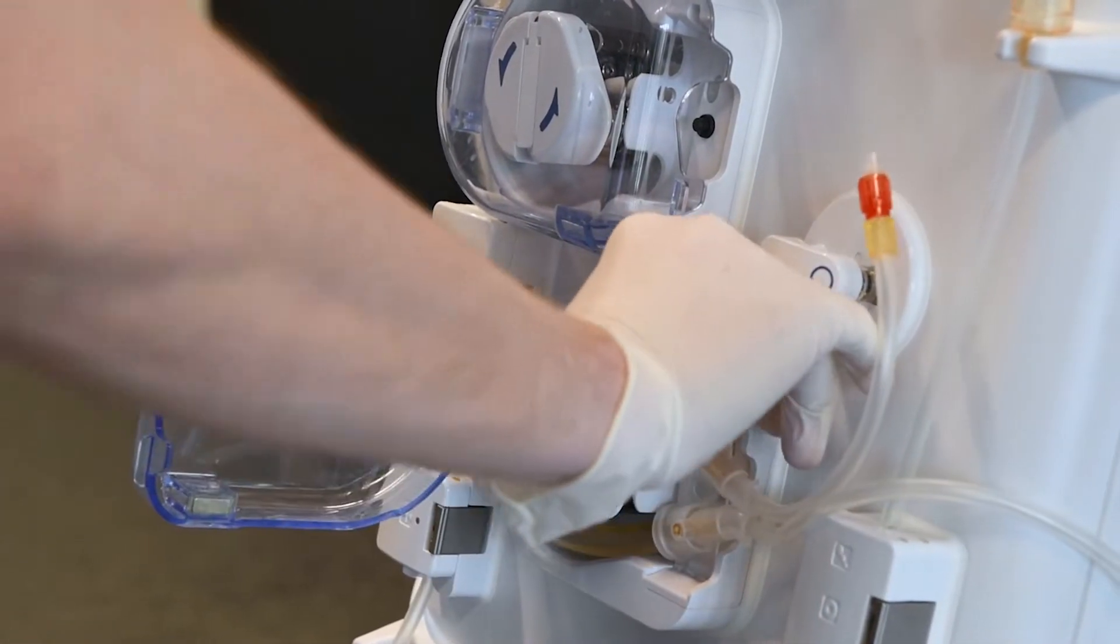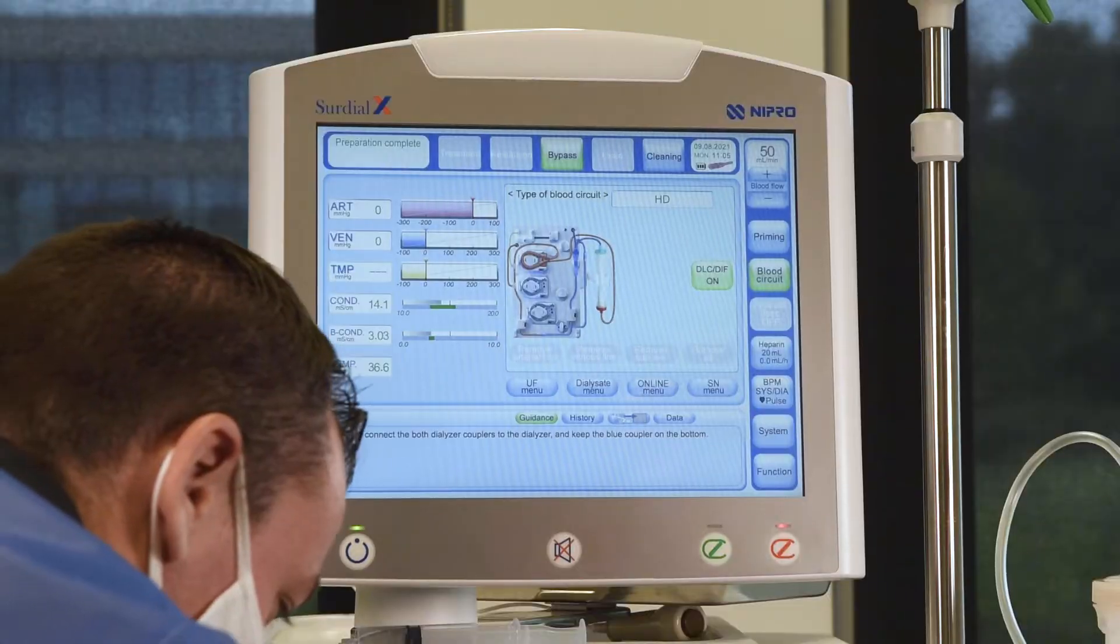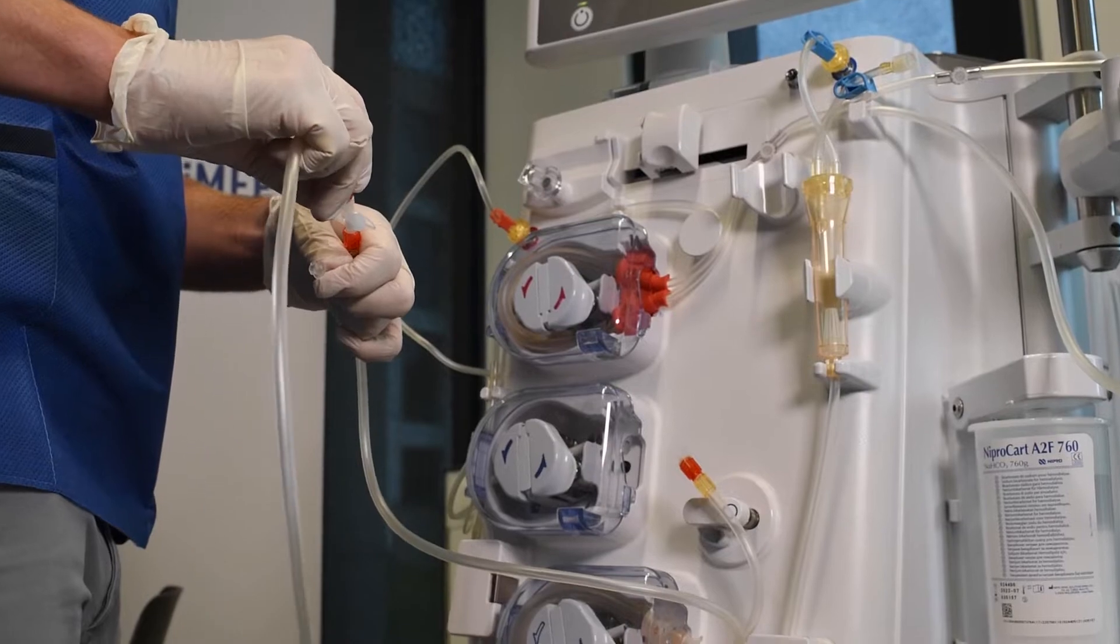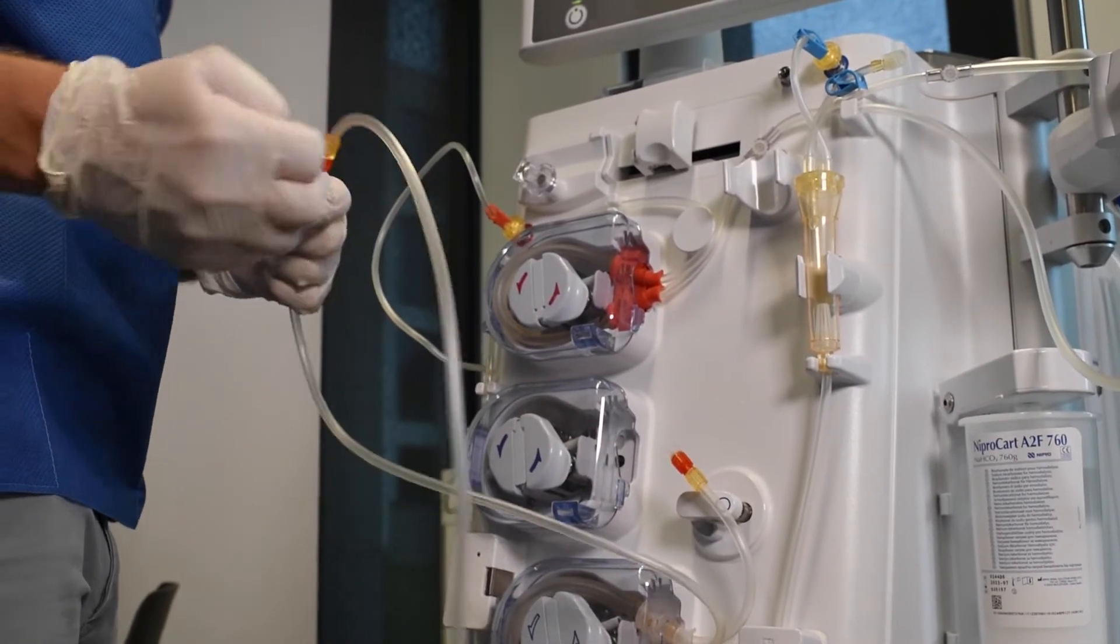Click the substitution pump segment into place. The screen will now change to show a HDF setup. Connect the arterial line with the longer substitution line.